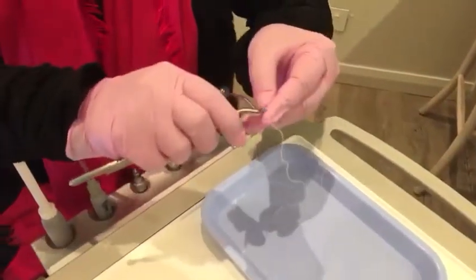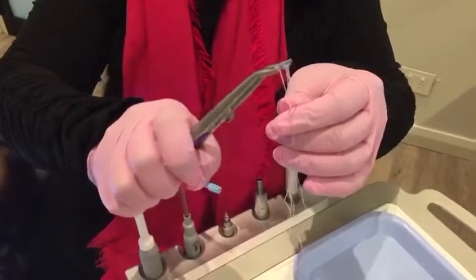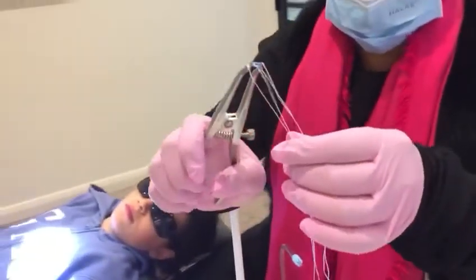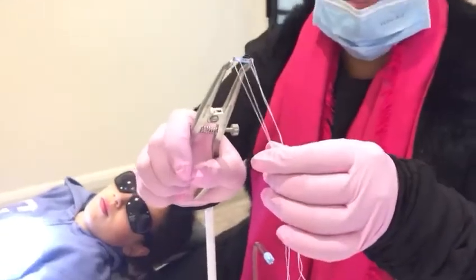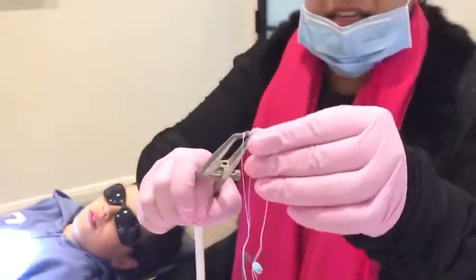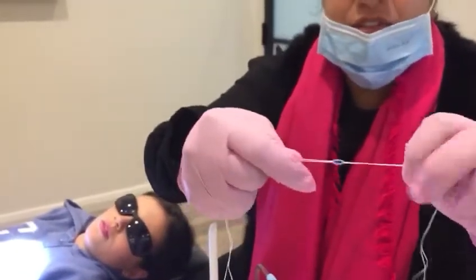The other option is a separating plier. You can put the donut on here and then separate it. But as you can see, this can really stretch the rubber band and can even break it sometimes, so they lose their elasticity. I actually love the floss method because you just can't stretch it too much.